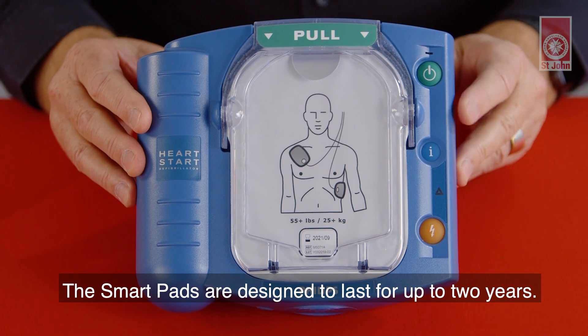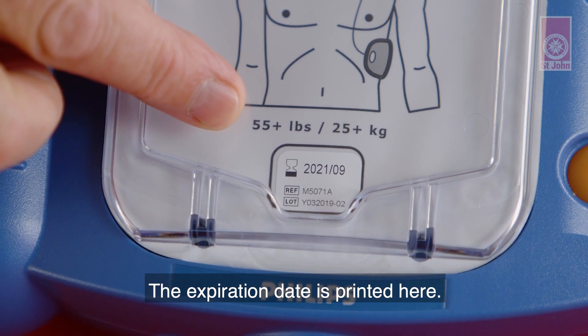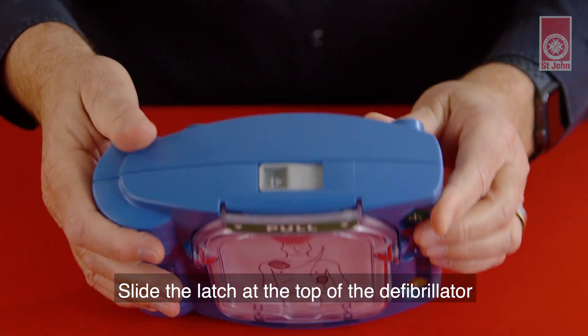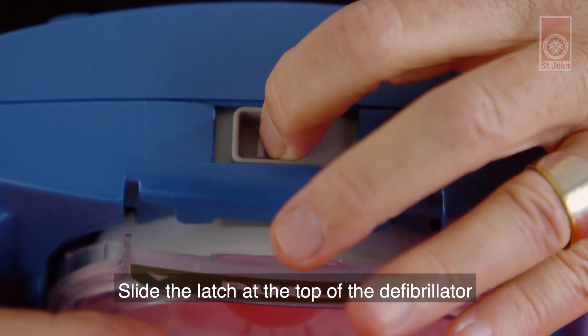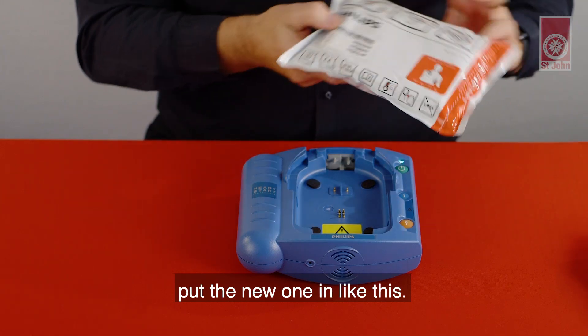The smart pads are designed to last for up to two years. The expiration date is printed here. To replace expired or used pads, slide the latch at the top of the defibrillator over to the side. Then lift out the cartridge and put the new one in like this.